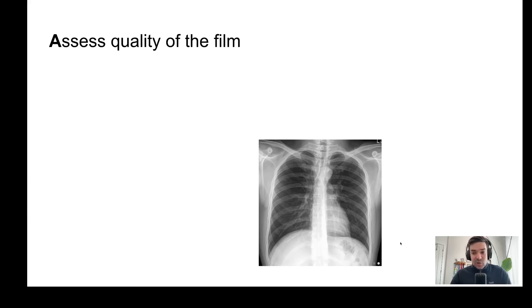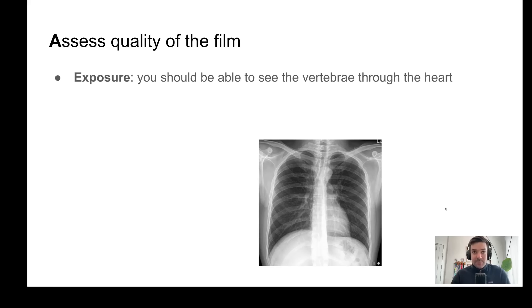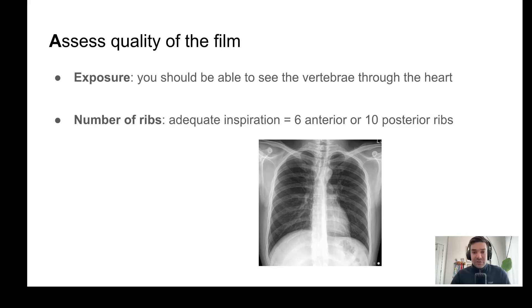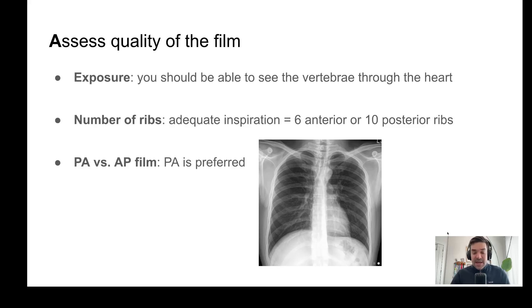Next in the mnemonic is assessing the quality of the film. For exposure, you should be able to see the vertebrae through the heart — and you can make out the vertebrae here through the heart silhouette. For the number of ribs, you can pause and count, but trust me there are six anterior as well as ten posterior.